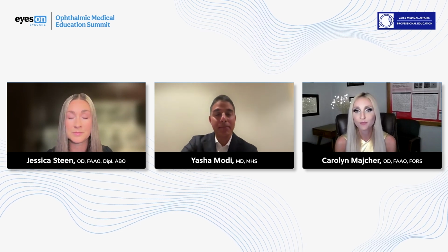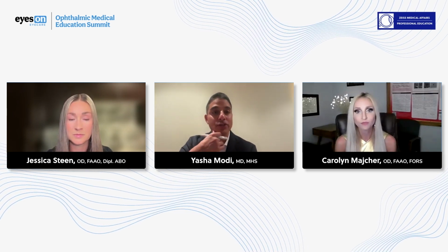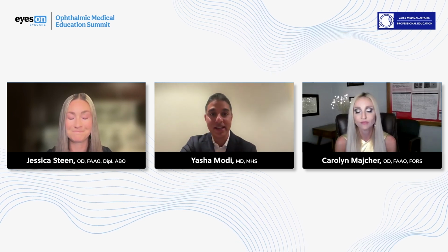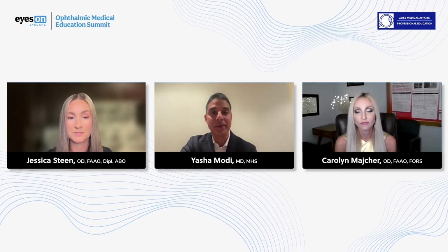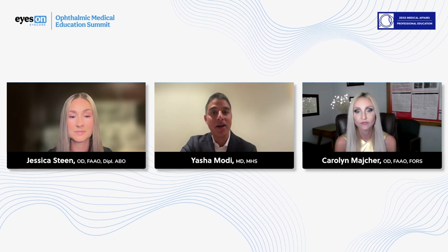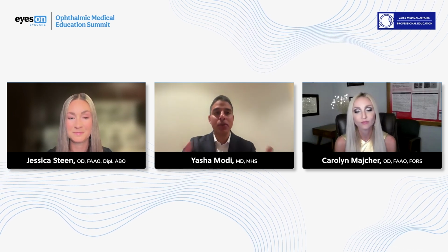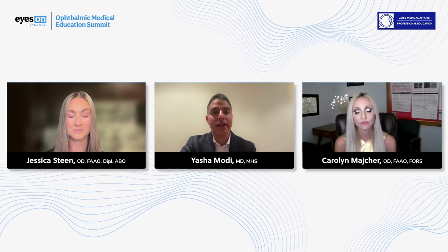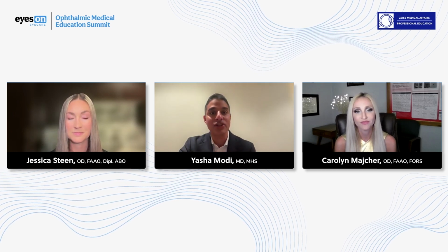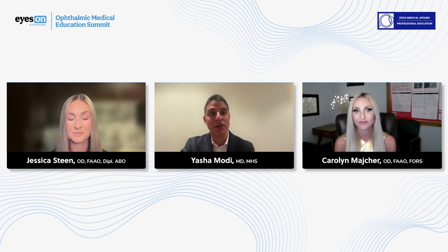Yeah, that's a really great point. If you're following these patients for glaucoma, they have considerable cardiovascular disease, hypertension, hyperlipidemia, diabetes. What you may actually be seeing on your GCIPL are these changes in the inner retina. I wanted to highlight that a lot of healthcare providers think about the retina, and when it's swollen, it's so incredibly obvious to detect change, to detect pathology.